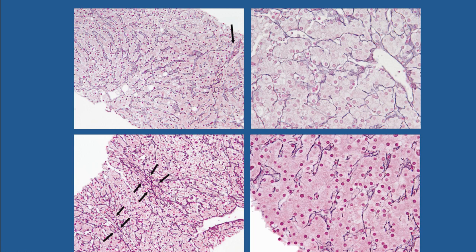The reticulin pattern will very nicely show small areas of cell loss, what is usually called reticulin condensation or reticulin collapse. And so here we see this reticulin condensation, and this is where cells were lost. In other words, there was some sort of hepatocellular damage. And you might not always pick that up on an H&E, or if you do pick it up on an H&E, it's very well confirmed by a reticulin stain.